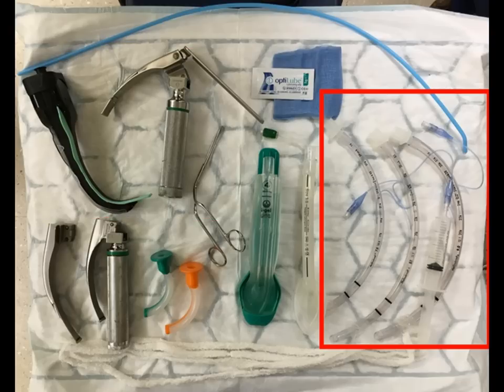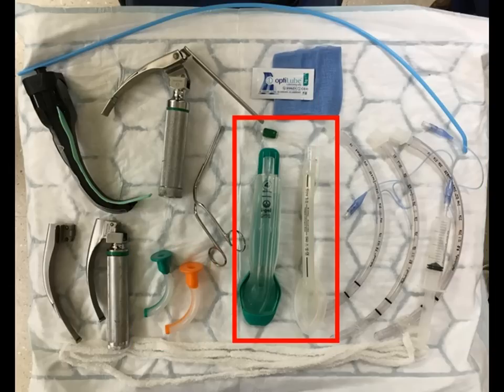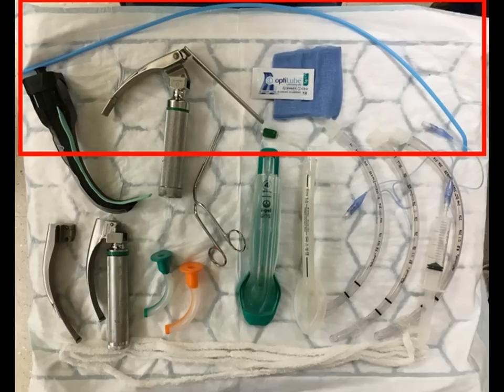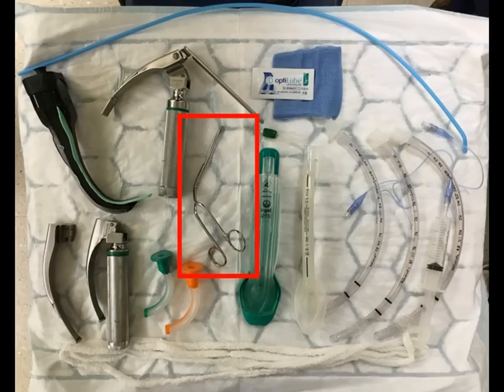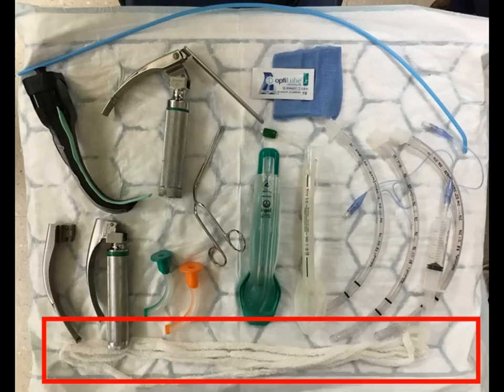Varying sizes of endotracheal tube with a syringe for adding air into the cuff attached to the balloon of the tube. Oropharyngeal airways, as well as a laryngeal mask as a rescue device. A bougie to facilitate access into the trachea. Magill's forceps. Lubricating jelly. And a tube tie for fixing the endotracheal tube in place.